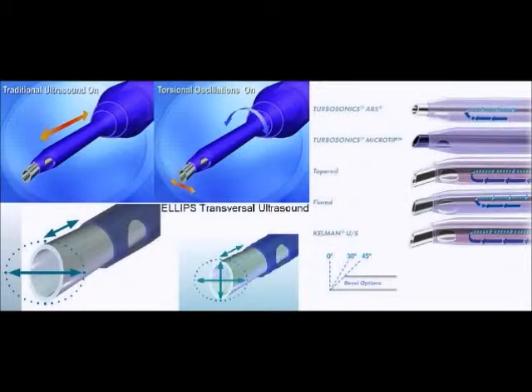Also, complicated manufacturing techniques of phaco tips produce beveled tips of various angles, curved phaco handpieces, and other variations in design. All of these changes to the phaco tip increase the cost of the system, development of the software to control the complicated parameters of the tip, and lengthen training for the system, as proper handling must be maintained during the procedure to avoid unnecessary injury.